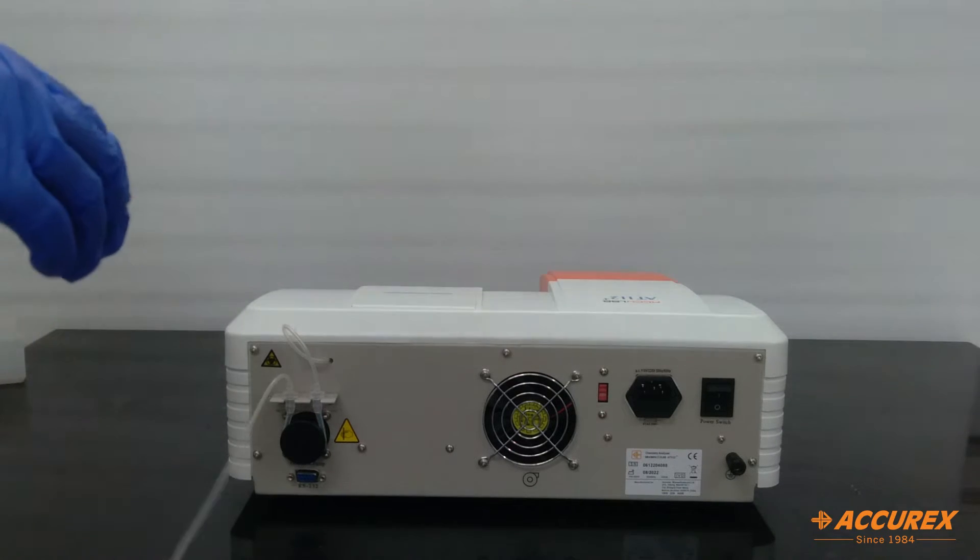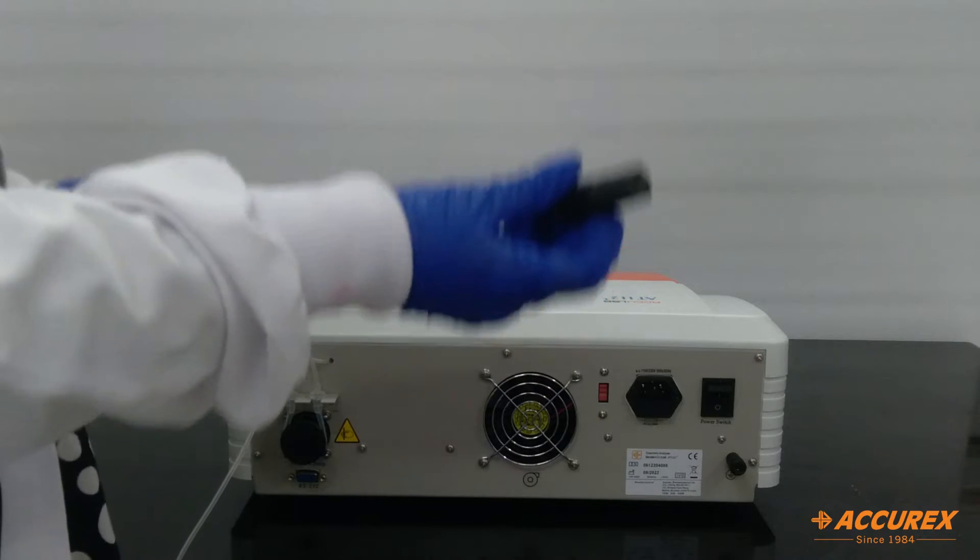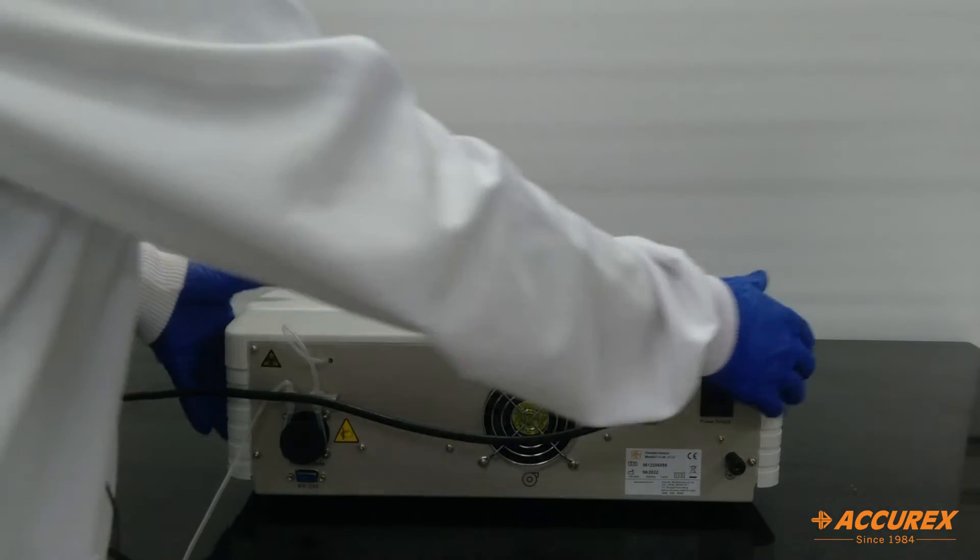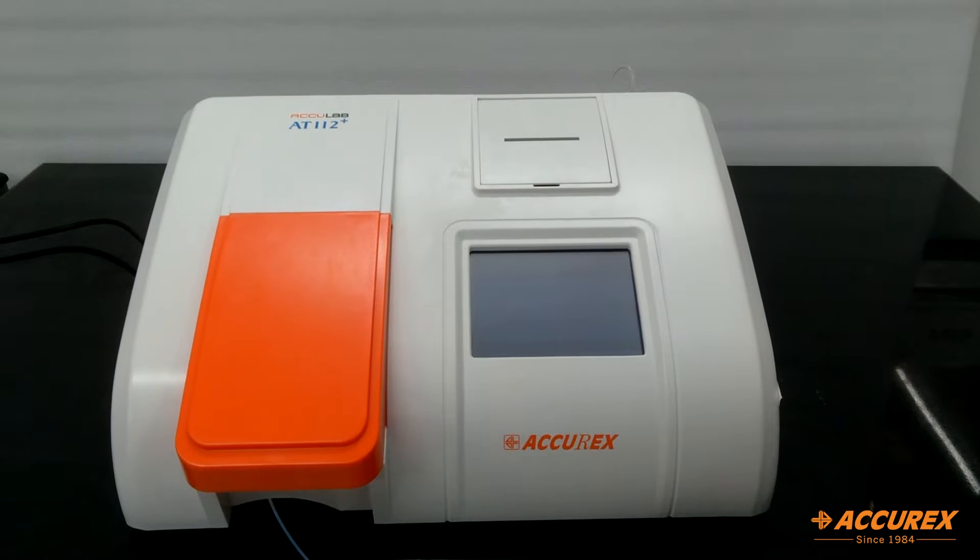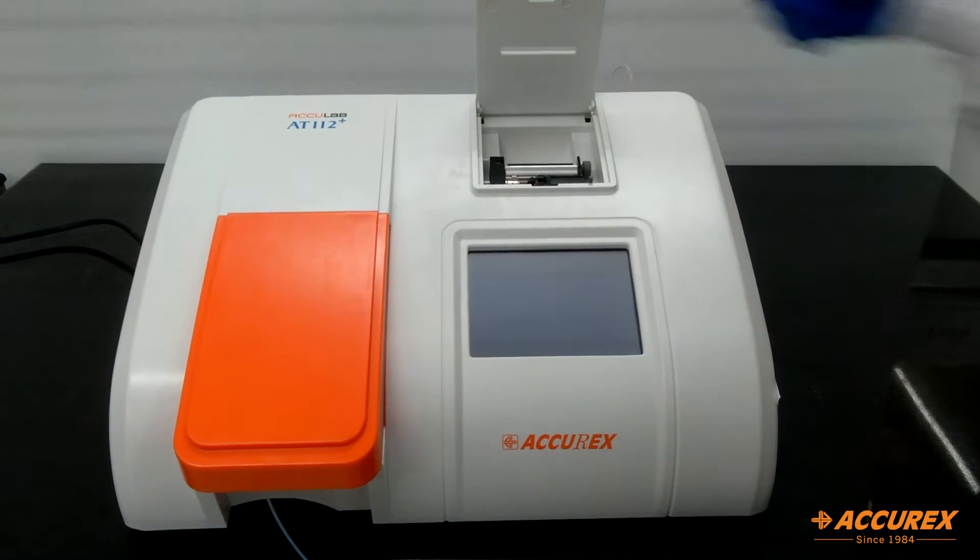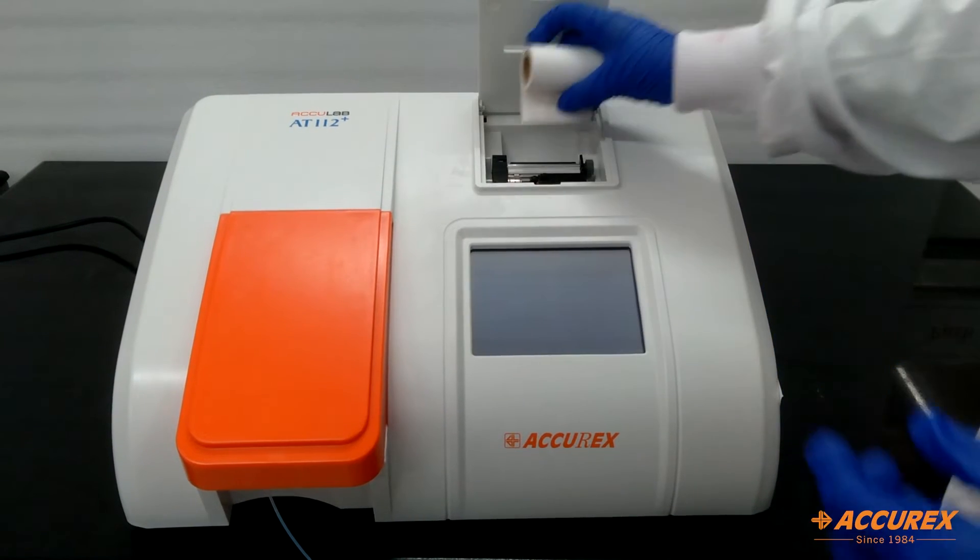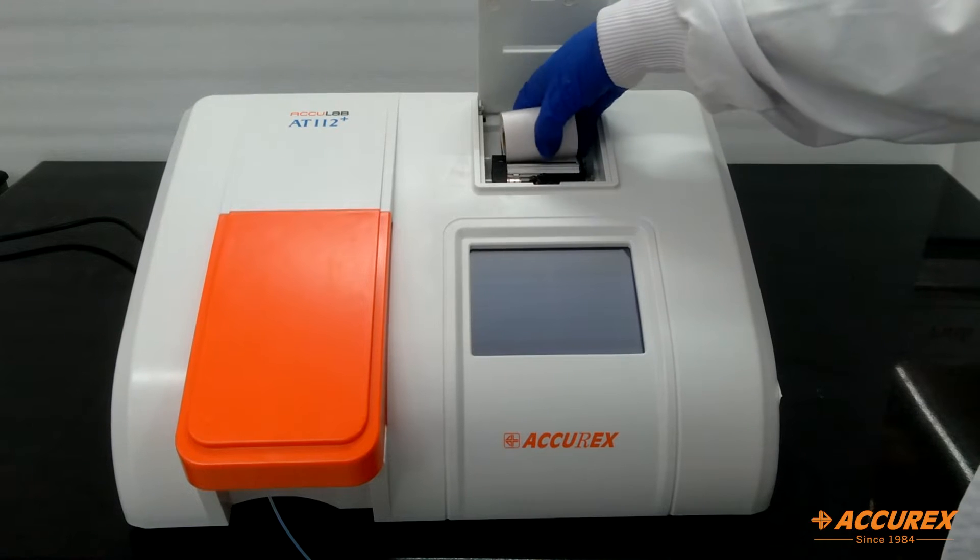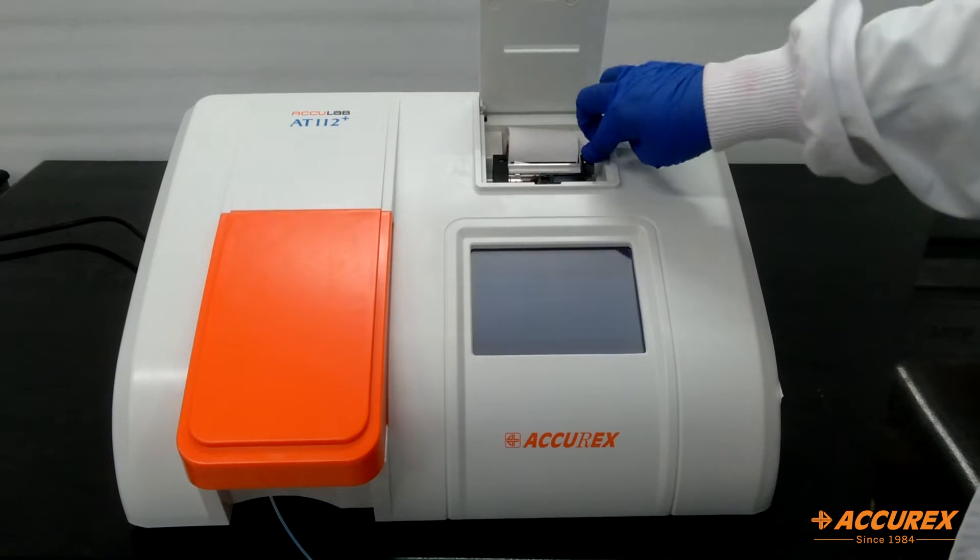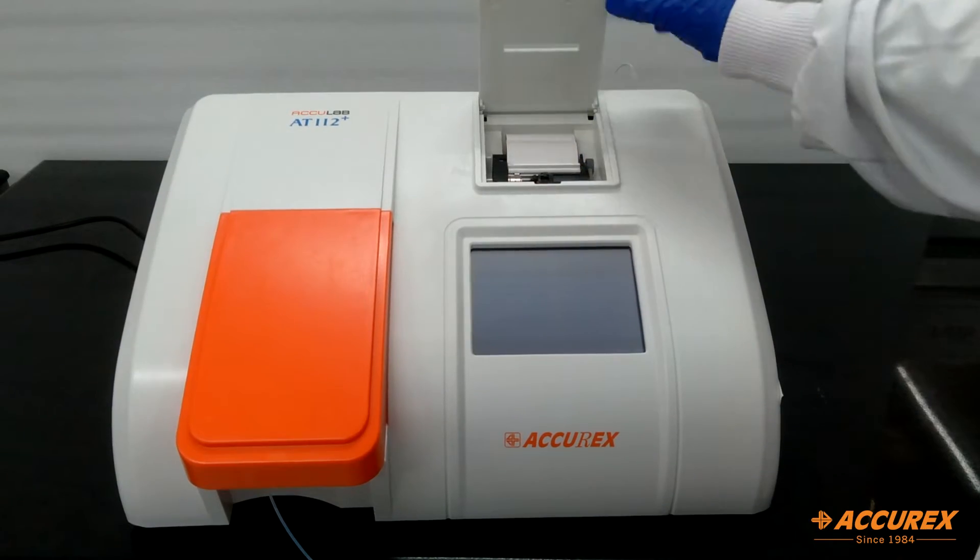And now we will see how to connect the power cord. So this is the power cord. We will just insert it in this socket. Now we will see how to insert the printer paper roll. We will open this, pull this flip, and insert the printer paper from here. We will roll this and the printer paper will come up like this. We will close the flip.